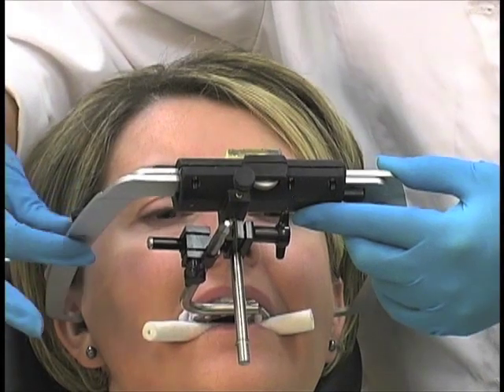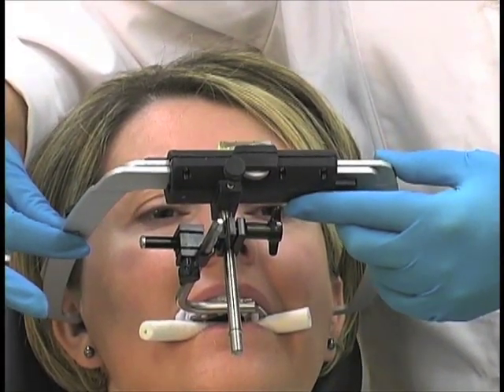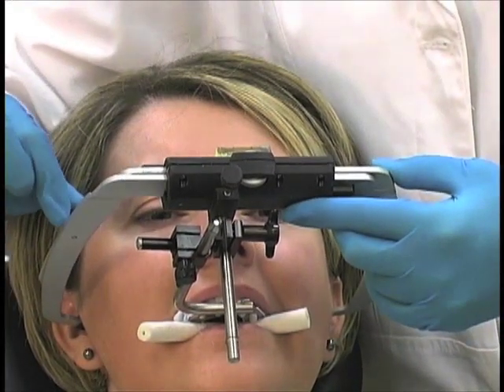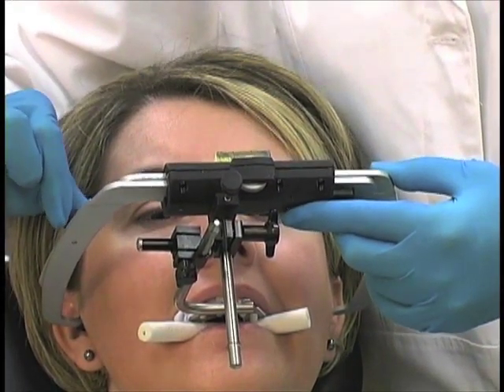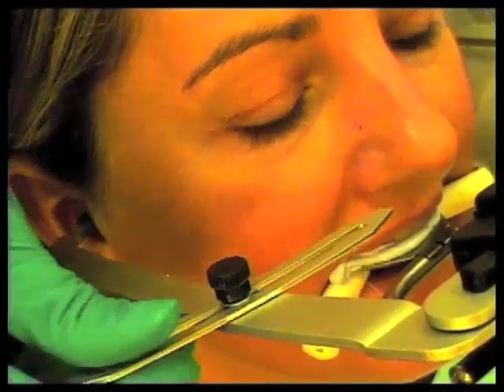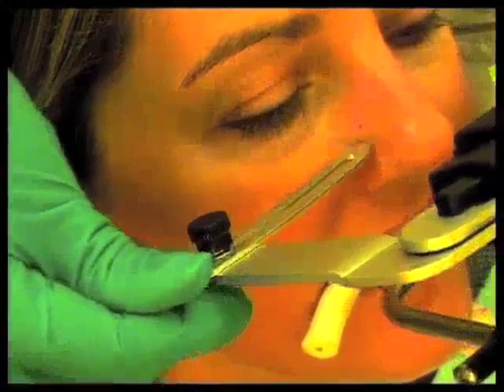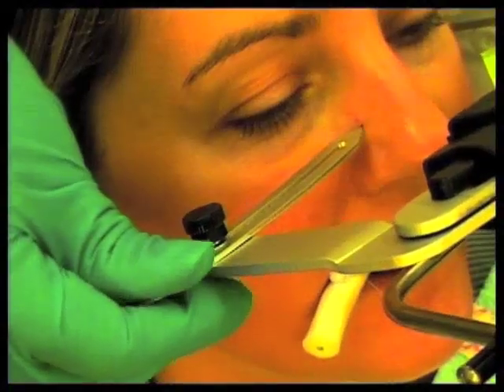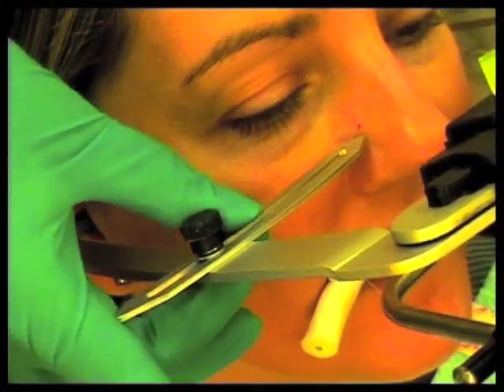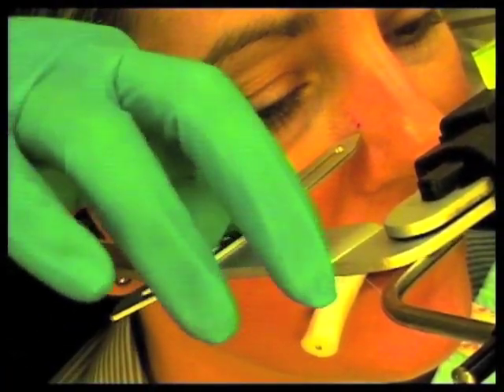One of the most important aspects of this procedure is now aligning the infraorbital pointer to the previously placed red dot on the lateral aspect of her nose. This is what's so critical about this face bow — it will center your cast on the articulator every single time. It's really simple but unique to the system and just makes it great. We go ahead and get that attached.